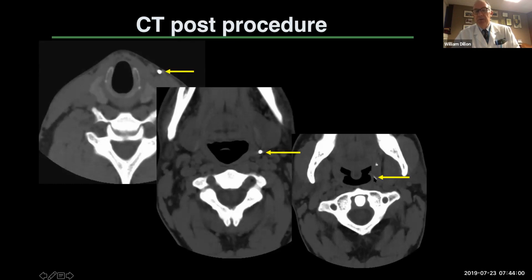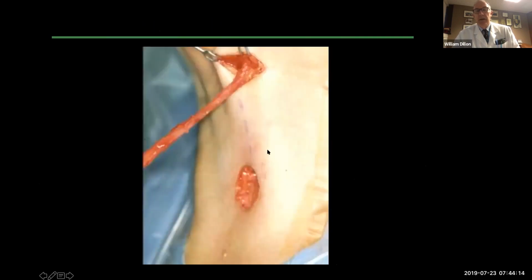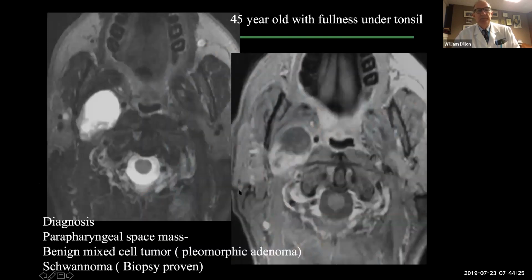and draining into it. So this is a branchial cleft anomaly, along which anywhere along that course can arise a cyst, and the second branchial cleft cyst occurs most commonly here. And they have to take this out, and here's a little surgical anatomy for you. This is the branchial anomaly being taken out in separate pieces from the neck.